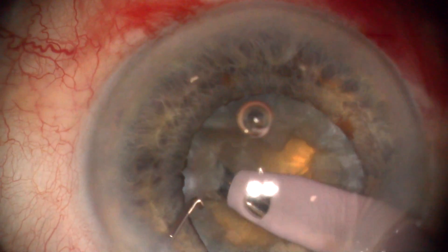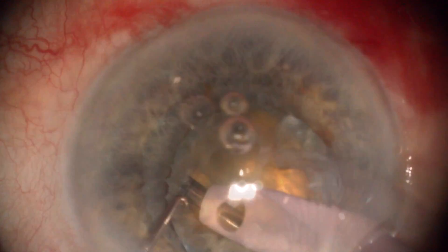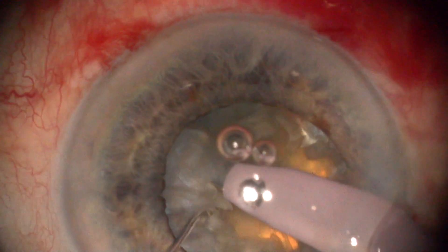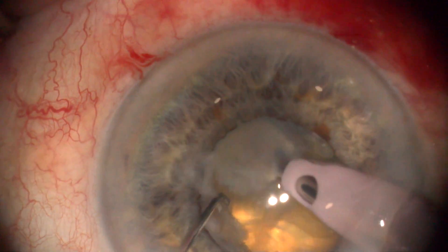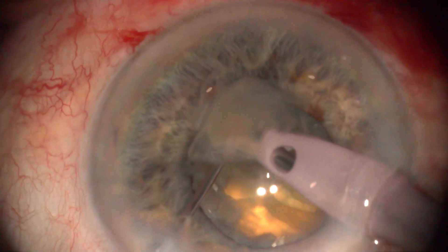After fragment impalement, we produce a hinged movement over the posterior plate and displace the fragment into the safe central area. Tangential chop breaks the posterior plate bond and results in a small fragment isolation.